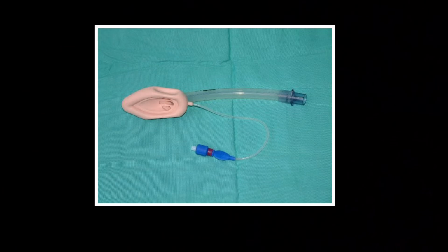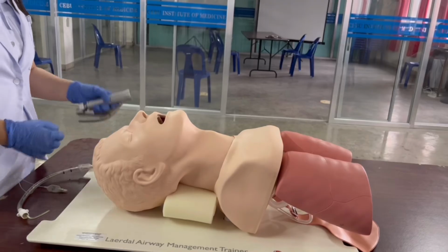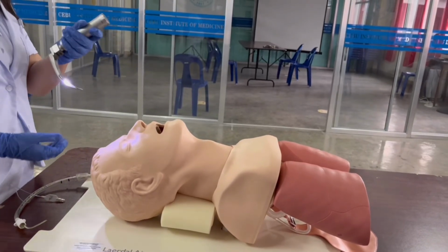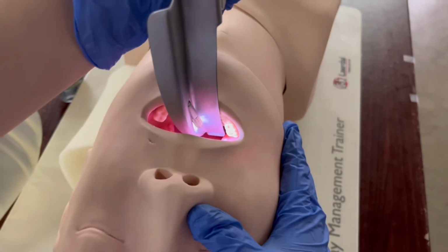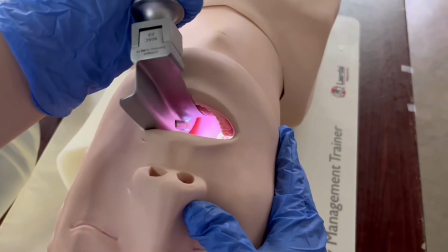A laryngeal mask airway is an acceptable alternative to mask anesthesia in the operating room, used when endotracheal intubation is not necessary. Advanced airway. The laryngoscope is held in the left hand and is inserted along the right side of the tongue, pushing the tongue to the left. Traction is then applied along the long axis of the handle to visualize the glottis opening.